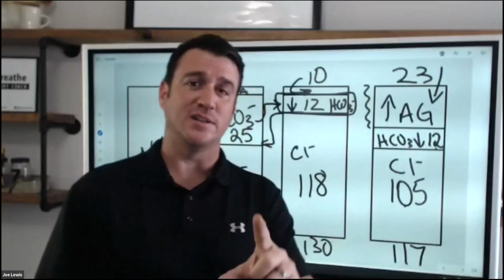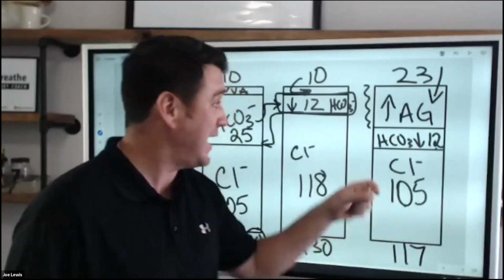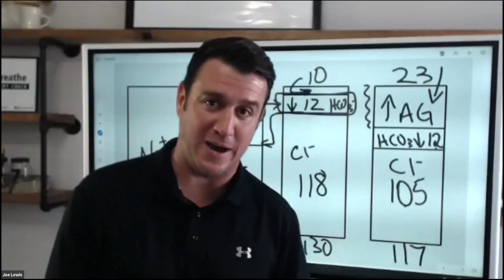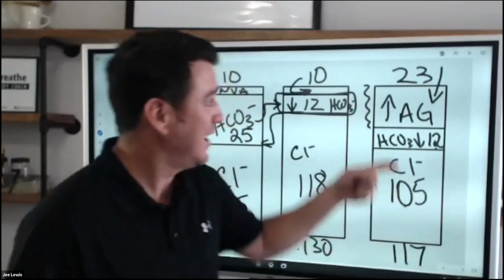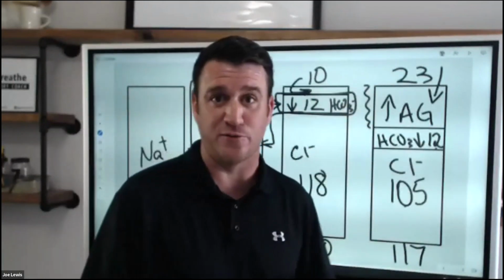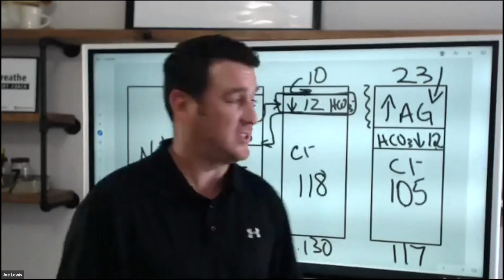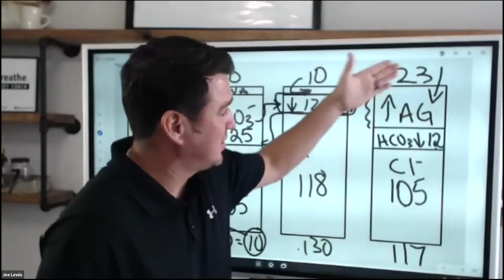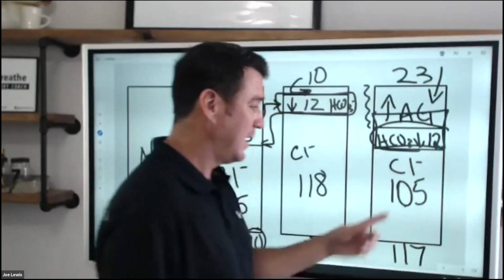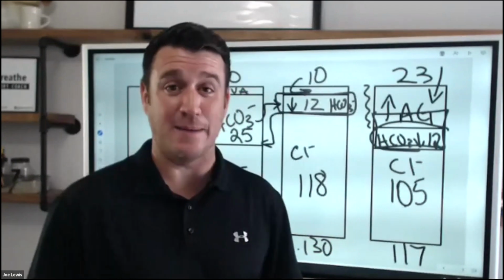Okay, Joe, help me make sense of this. How come the chloride didn't rise? Because while the bicarb looks decreased, it hasn't left the body. It's just occupied. What's it occupied with? The increase in these non-volatile acids, so the lactic acidosis from your septic patient, your DKA patient, your renal failure patient. This increase in non-volatile acids is just occupying what used to be here. So chloride remains normal, bicarb goes down, increased anion gap goes up.